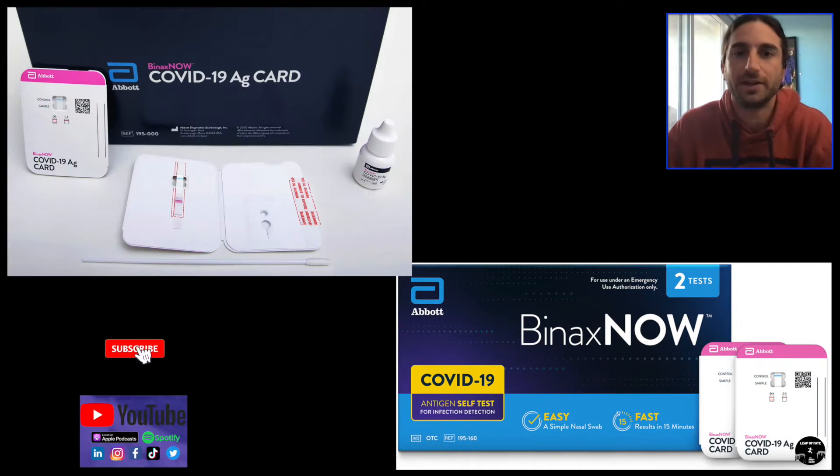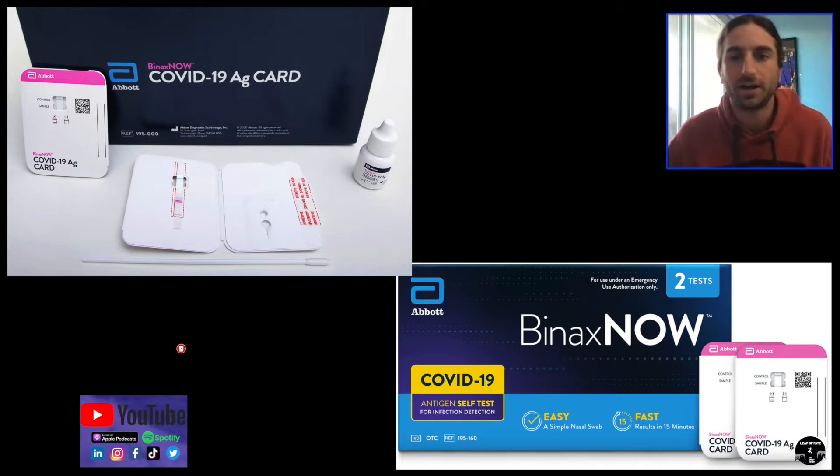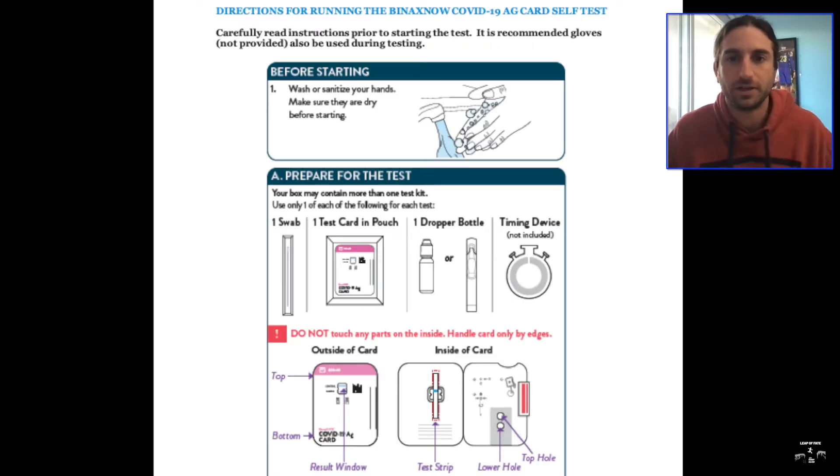This is what the test looks like. You'll get two tests inside the box. Once you get the box you'll be able to see the instructions in it. Going through very quickly — these are just basic instructions, and then we'll go through where you prepare the test with what's in it.